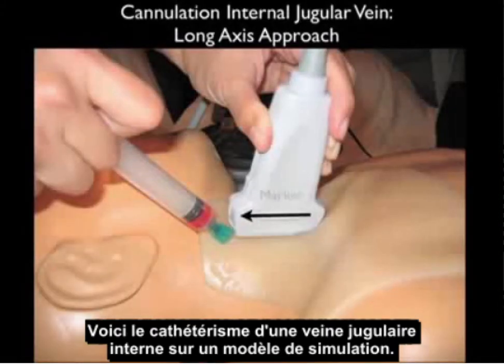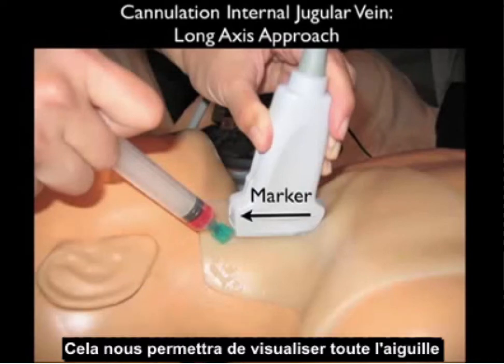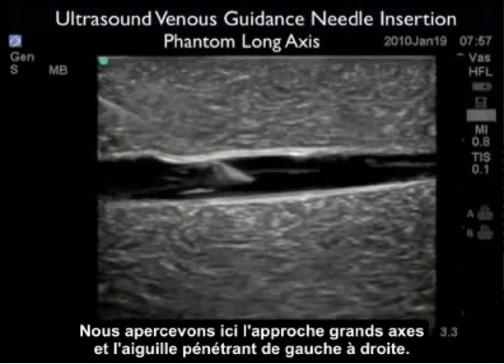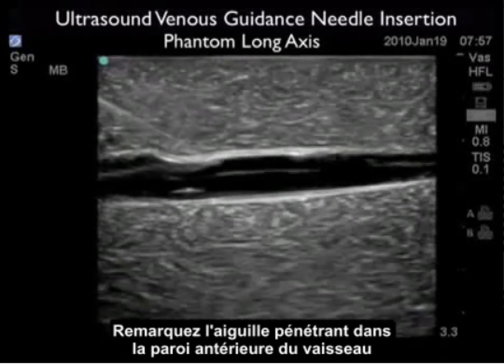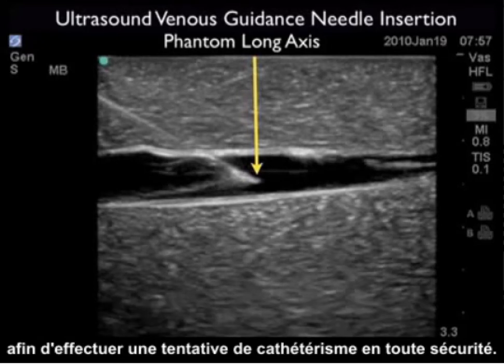Here we're performing cannulation of the internal jugular vein on a simulation model. Notice the probe is oriented along the longitudinal or long axis course of the internal jugular vein with the marker dot distal or towards the patient's head. Here we see the needle coming in at a 45 degree angle underneath the distal aspect of the probe. This will allow us to see the entire aspect of the needle as it travels down from the surface all the way down to the venous lumen and cannulates the internal jugular vein. Here we see the long axis approach with the needle coming in from left to right, and note how the long axis orientation is excellent for seeing vertical needle depth. Note the needle coming through the anterior wall of the vessel and the needle tip squarely within the vessel lumen. The long axis orientation allows us to plan the optimal depth for the needle tip with regard to the venous lumen to squarely secure a cannulation attempt.